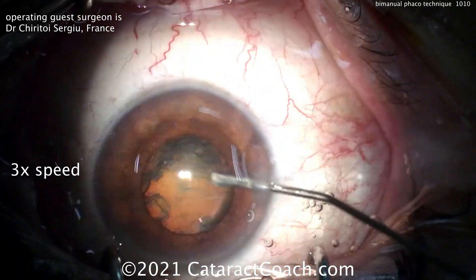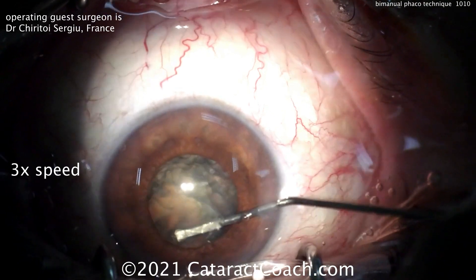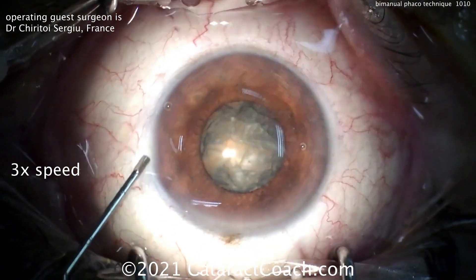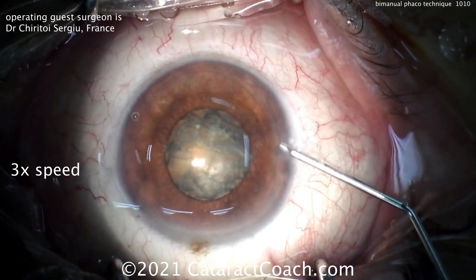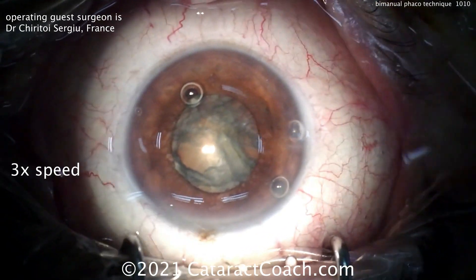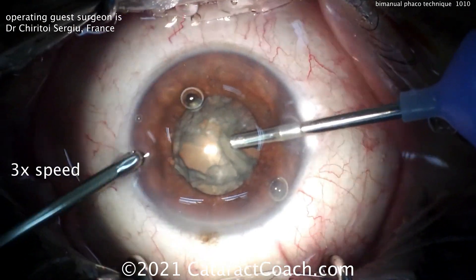Believe it or not, this technique was quite popular in the U.S. and around the world for quite a few years, back in the mid-2000s. One of the challenges, of course, is with a smaller incision you've got smaller fluid flow — remember Poiseuille's equation — and so it's related to the size of the tubing.